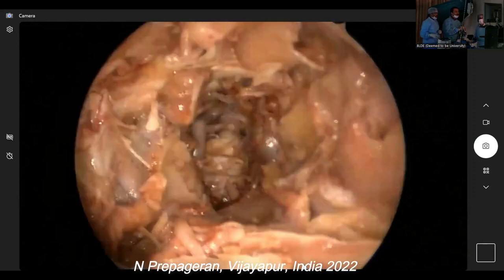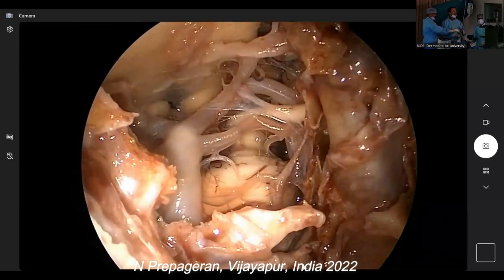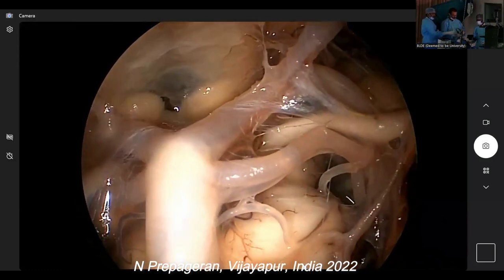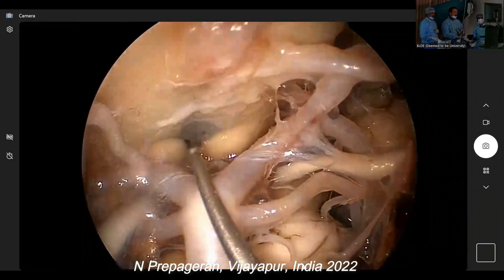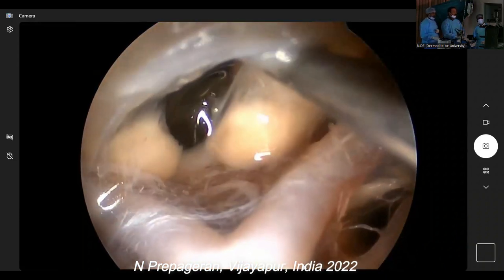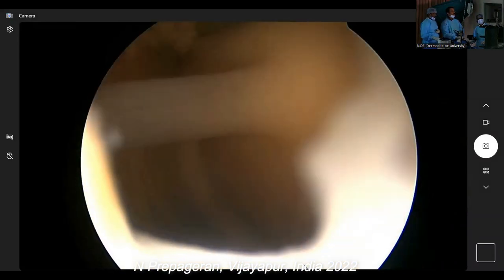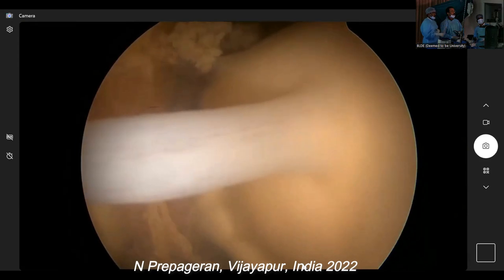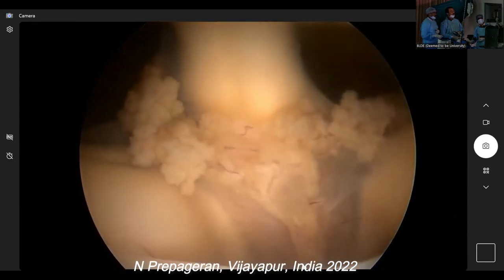Okay, guys, ball probe. Let's hope for the best. So this now is the third ventricle, correct? Yes, sir. With a 30-degree scope, let's see whether you can see the foramen of Monro. Ah, foramen of Monro, left. Yes, sir. Foramen of Monro, right.